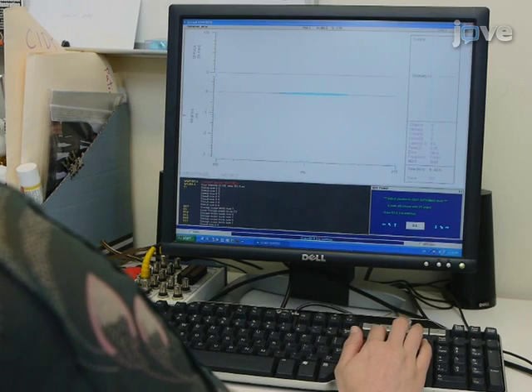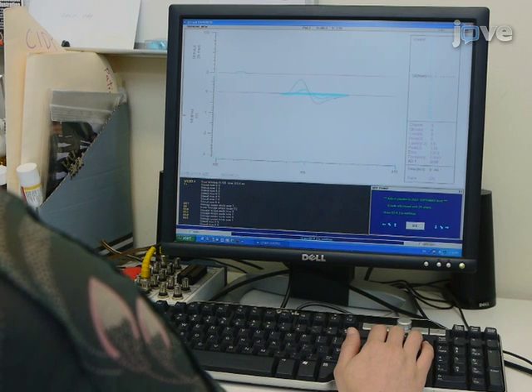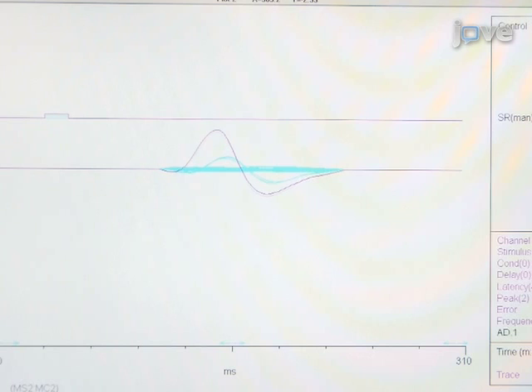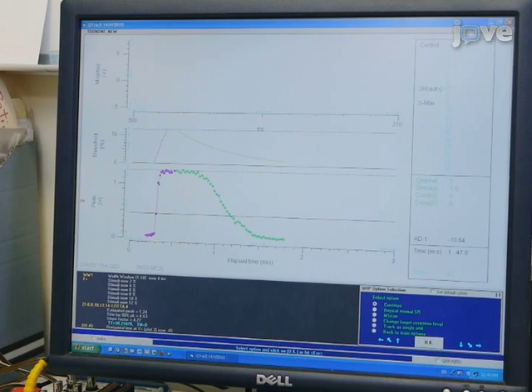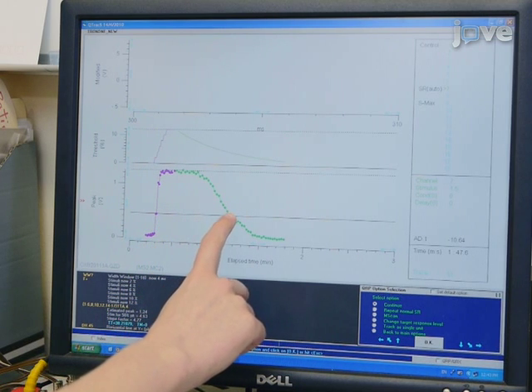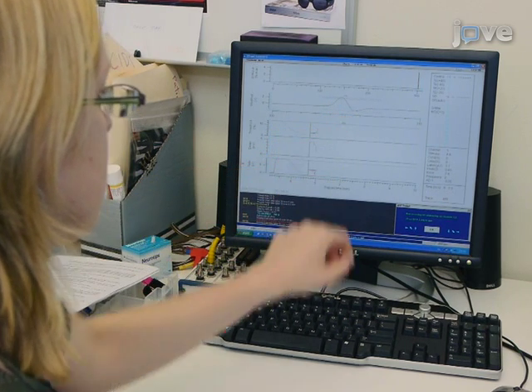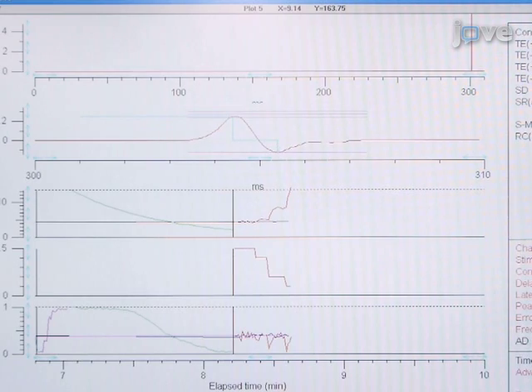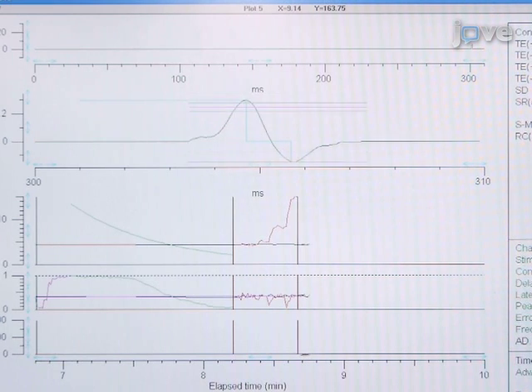To begin the excitability protocol, record a stimulus response curve by incrementally increasing the stimulus until the response is maximal and does not augment when stimulus intensity is further increased. The target amplitude for threshold tracking should set automatically to 40% of maximal amplitude, corresponding to the area of steepest slope on the stimulus response curve. Changes in threshold current required to achieve the target amplitude should be tracked online. Record multiple excitability parameters, including threshold electrotonus, recovery cycle, and current threshold relationship.